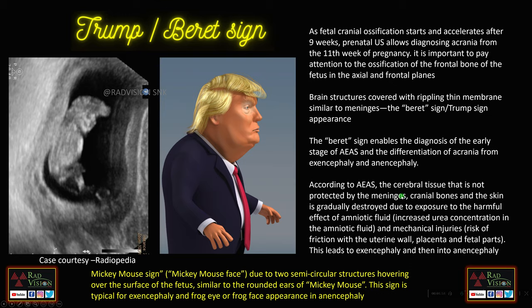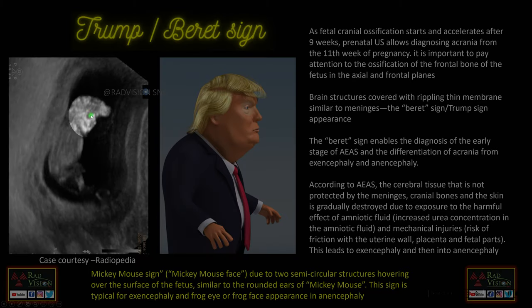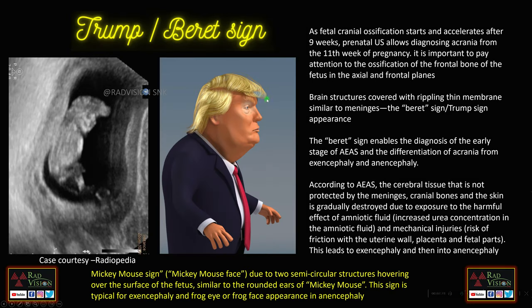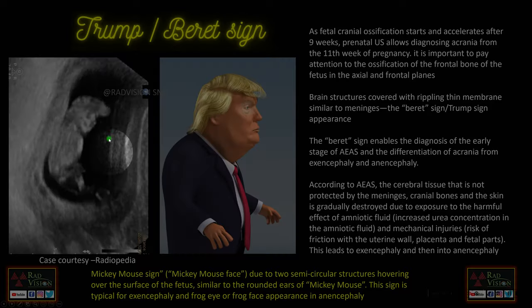Next is the Trump sign or Barrett sign. Fetal cranial ossification normally starts at nine weeks and by eleven weeks you can easily see ossification of the frontal bone in the axial plane. In this case, there is no ossification of the frontal bone and the brain structures are covered by a very thin membrane similar to meninges — this is the classical Trump or Barrett sign. Whenever you see this Barrett sign, definitely suspect acrania, because it mimics the hair of Trump.